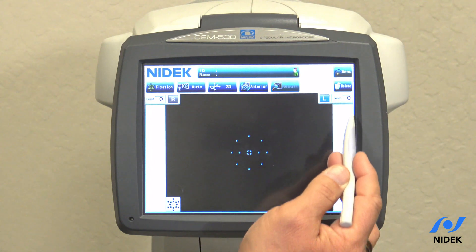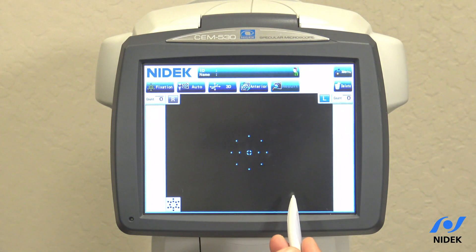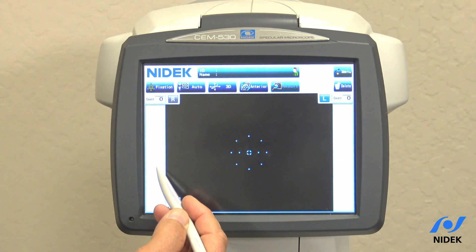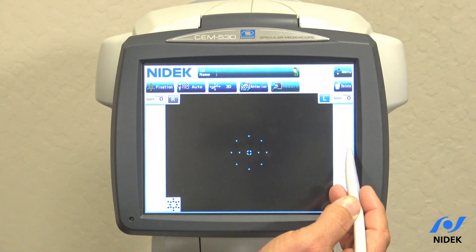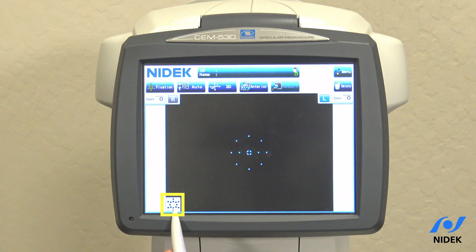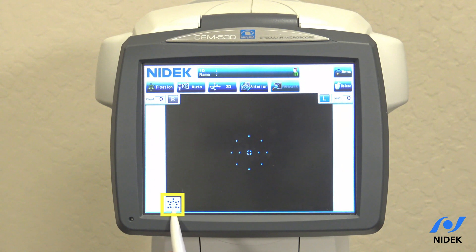Your results tab is also available. To delete patient data, you would click on the delete tab. The count tells you how many images have been taken on the right and how many on the left. The display here shows the area that we're going to be capturing. If you select multiple areas, those areas will appear pink until they are completely captured.